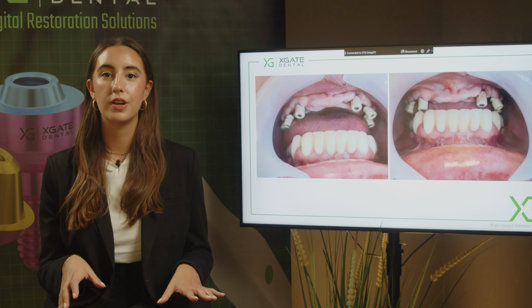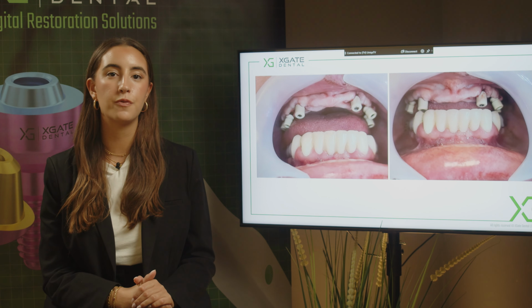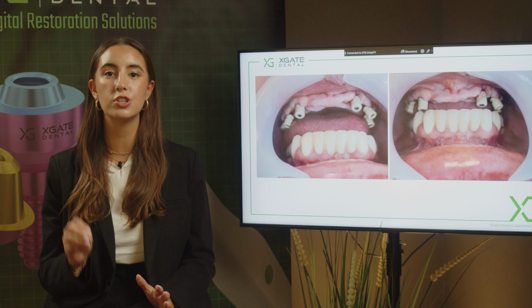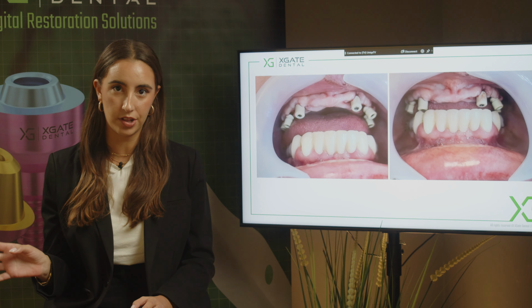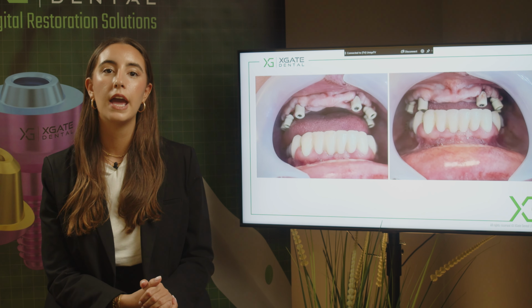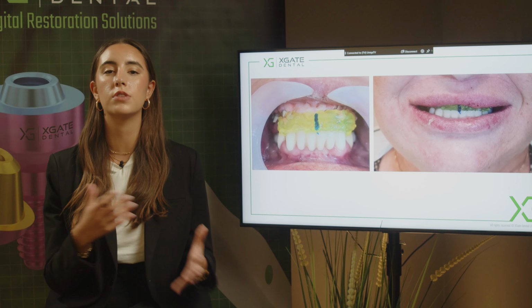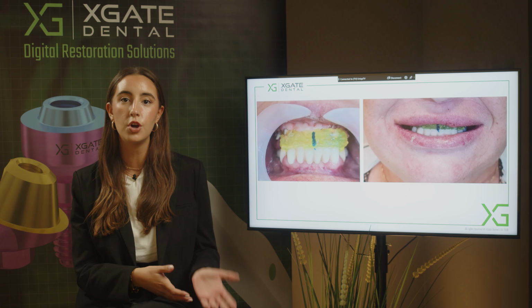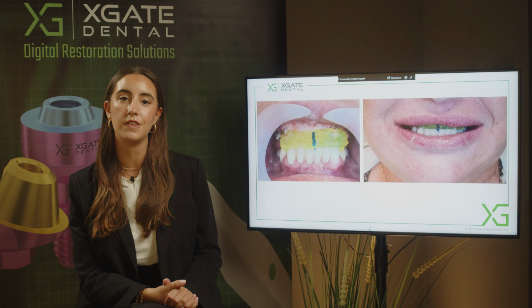Right now, you have the orientation of each implant. You don't know if there are any relations between the upper and the lower jaw. So we took impressions of all of the palatal area, and right now, we want to make some sort of composite bulk. And with this composite, we want to, let's say, fix the VDO, the vertical dimension. And on this buccal, we want to paint the central line and the occlusion.